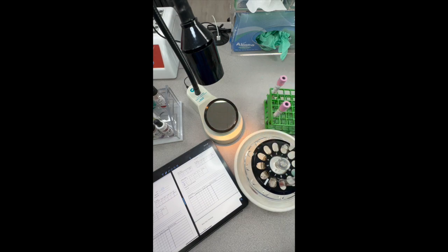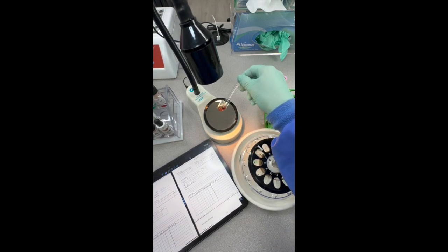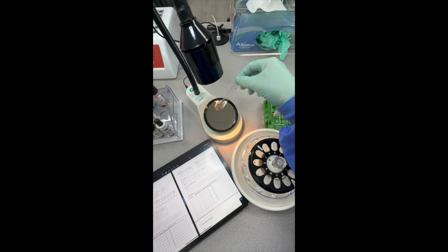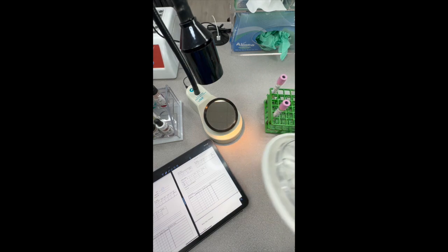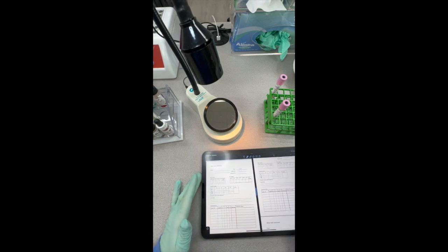So we're going to go ahead and recentrifuge that with one extra little check cell in here. Make sure that comes up positive. Okay. Let's look at these again and see if we get a better reaction now. And there we go, positive reaction on that. We're getting some positive check cells there. So those come off. Now let's take a look here at our patients.